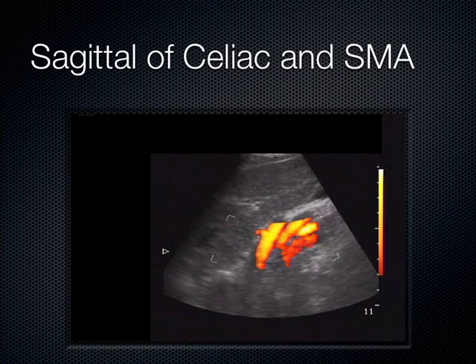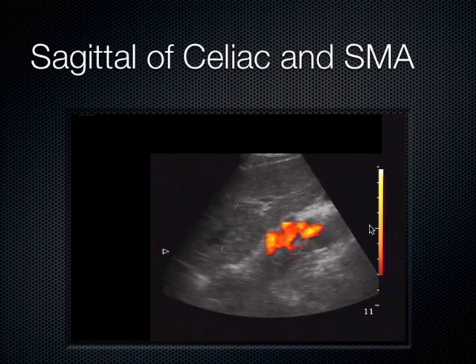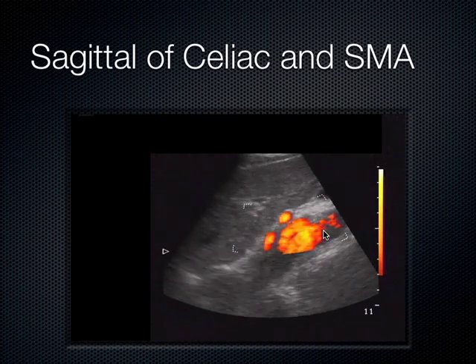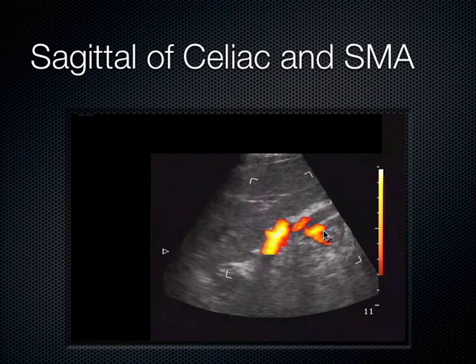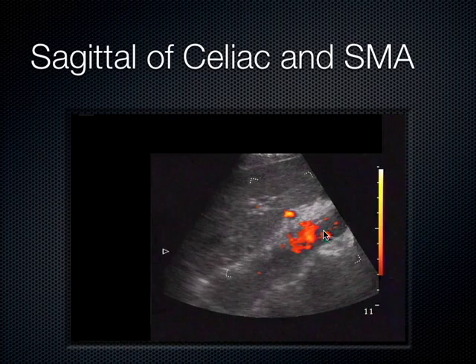And on ultrasound, this is an example here of a sagittal view with the aorta kind of running along here. And we can make out with the color here, this is that first branch, celiac, second branch, SMA, and this is just some flow left in the aorta where this happens to be picking it up. So just to show you that while you don't really need color for much here, with the aorta it just kind of helps to outline it.